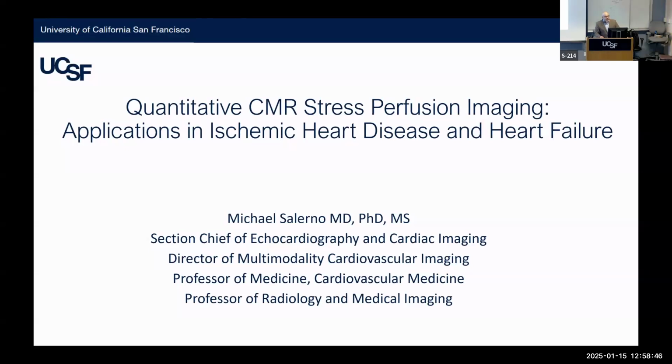patients who need an ischemic evaluation and where you're also not sure if they could have a non-ischemic myopathy. Some of the new onset heart failure patients that we know have known coronary disease, where the question is how much is scar and how much is ischemia. I think those are the spots where MR really shines. You could do it across anybody, including somebody who's very low risk, and it's a low risk procedure. But I think the sweet spot is the more complicated patients.